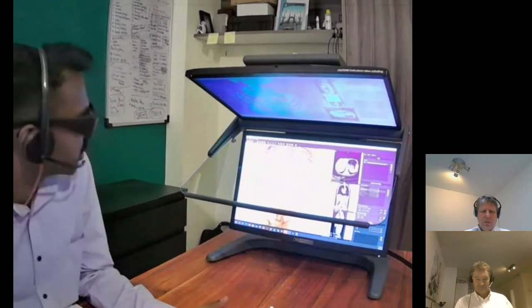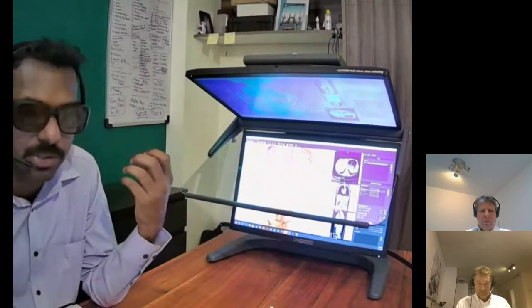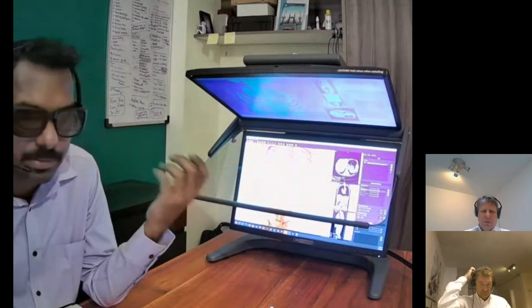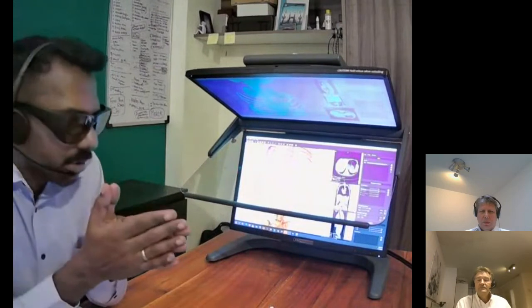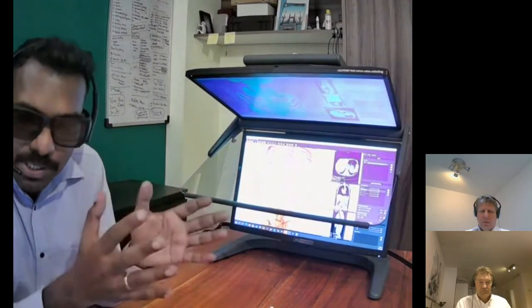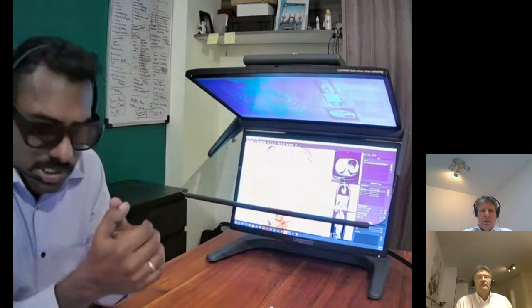So I was looking at the data sets in true stereoscopic. What is the advantage of stereoscopy is the depth, how much depth you can see in the data set. With the right software like Vesalius, we can interact with the models in a much better way than what we are doing. One of the advantages we feel, Aryan, if you agree with me, is that you can minimize the amount of 3D printing, because you can clean it.